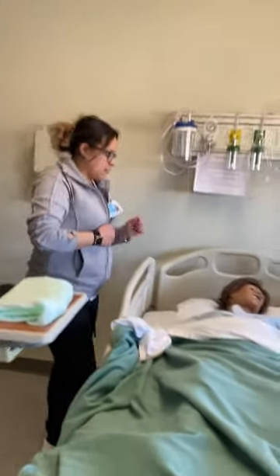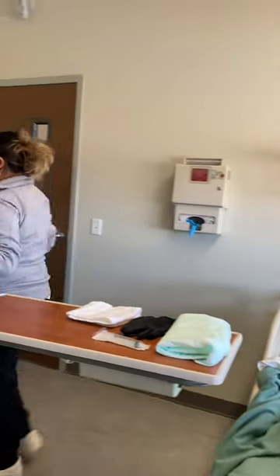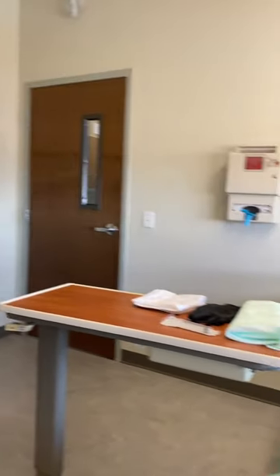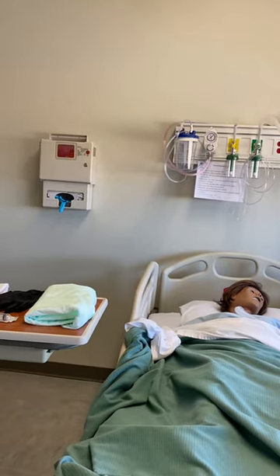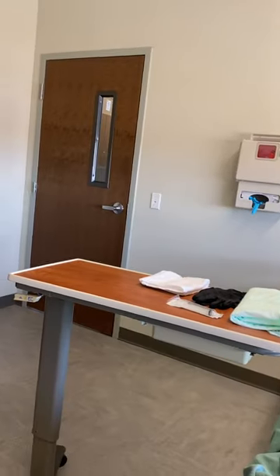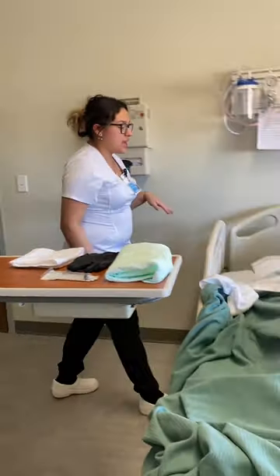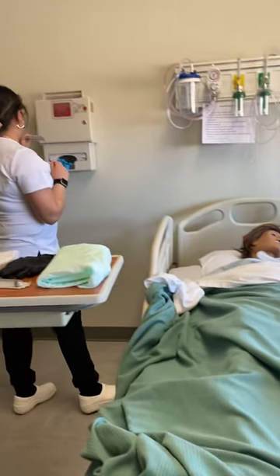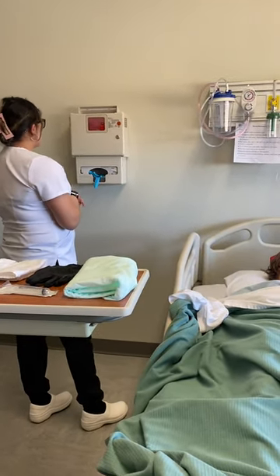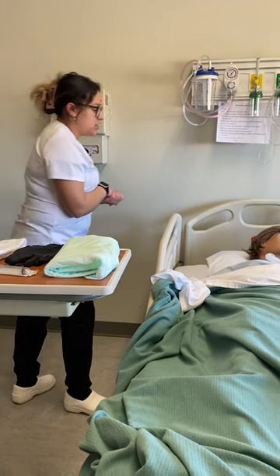I'm going to go ahead and take off my sweater — it's a little hot in here. Sorry. Alrighty, I'm going to go ahead and sanitize my hands one more time. Yes, you are the person I'm looking for. I'm going to scan my badge and it looks like we have an order to discontinue your Foley.